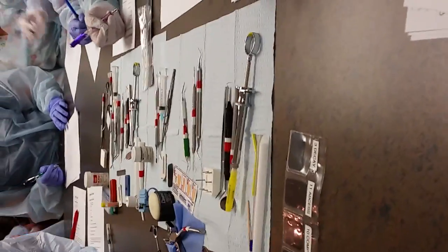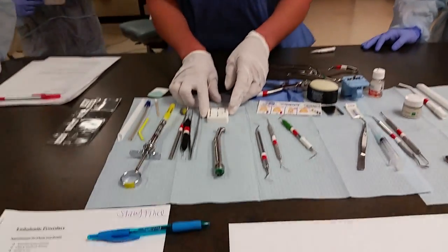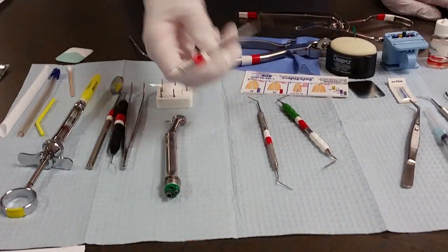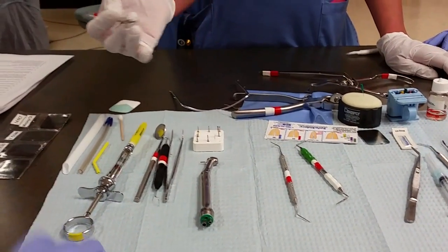With topical anesthesia, we have various burrs. These burrs are generally going to open up a tooth with a round burr, because we're going to go deep into the canal. We just need to make sure that it's a round burr and a high-speed handpiece in order to access the canal. We also have a curette, which is used to remove soft tissue and any decay within the cavity.